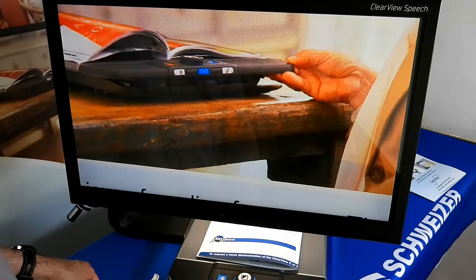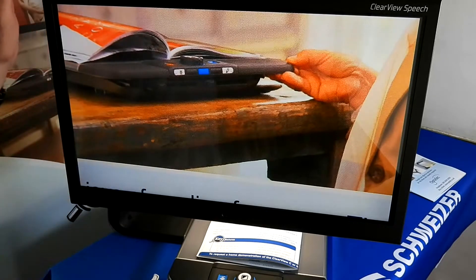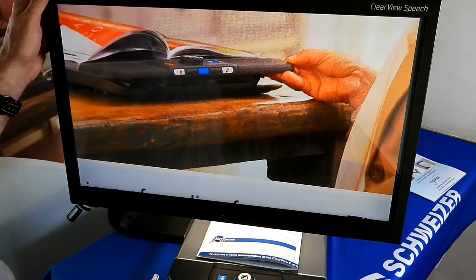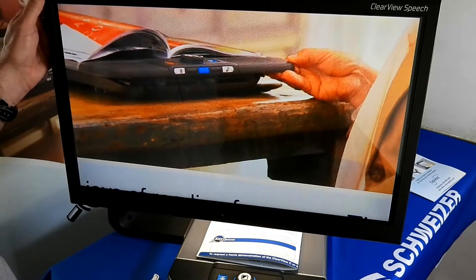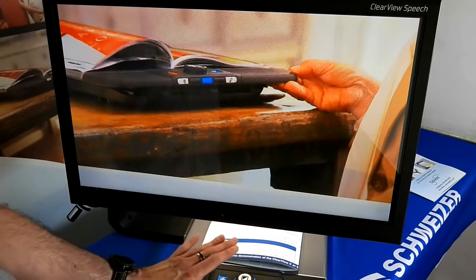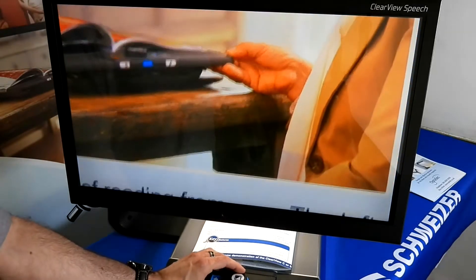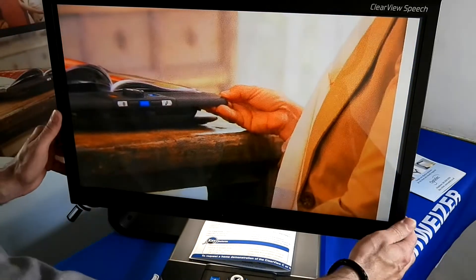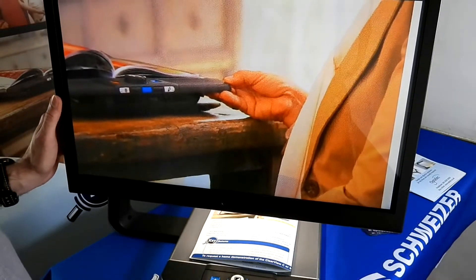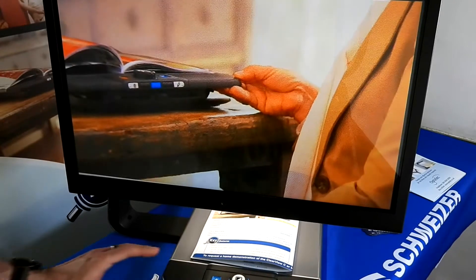Hello and welcome to another Optelec Enhanced Vision product demonstration. Today is part two of our Clearview C. What we're going to emphasize this time is the speech aspect of our Clearview range. The previous video discussed how the basic video magnification works with all the control panels and the XY table, but today we're going to concentrate on the actual speech side of it.